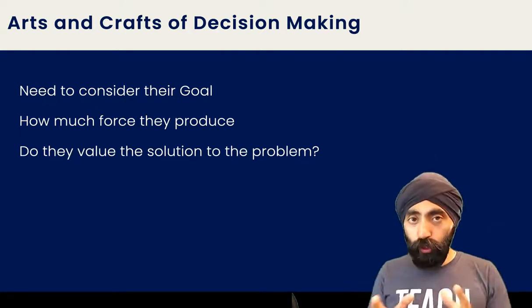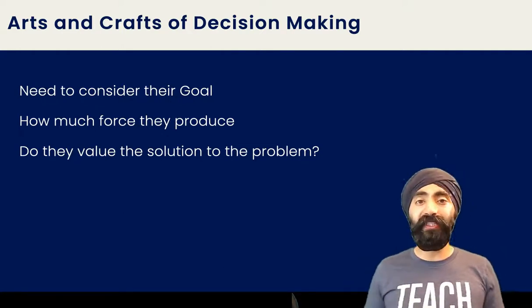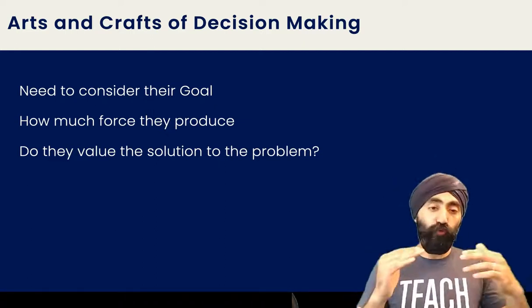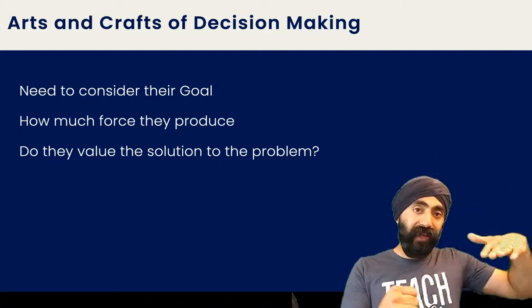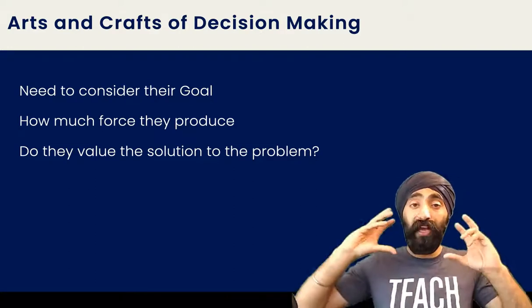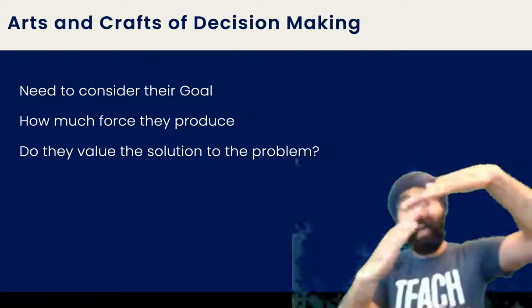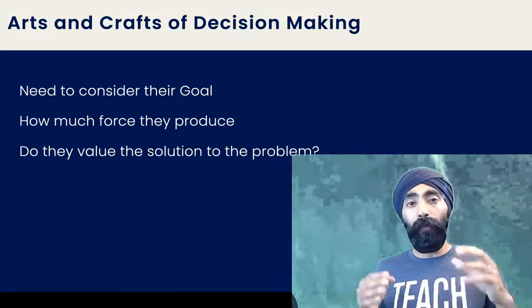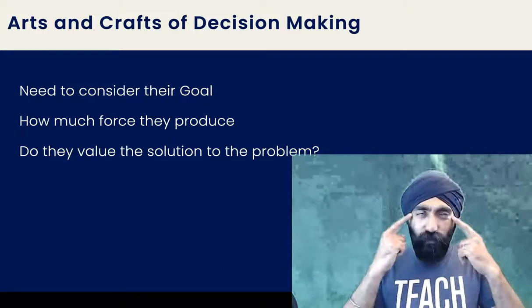But before you go out there and start prescribing this appliance, there is a bit of a thought process. There is some diagnostics to be done. You have to check how much of a slide they have, because sometimes what happens is that muscles relax so much that they can get an anterior open bite. So there is a little assessment to do, but just something to give you some ideas.